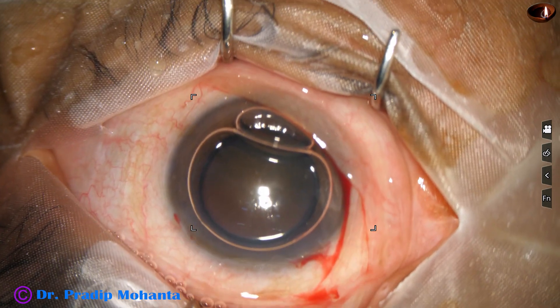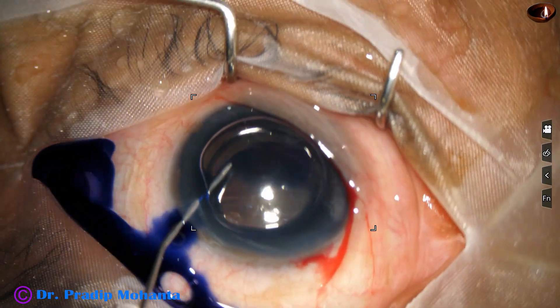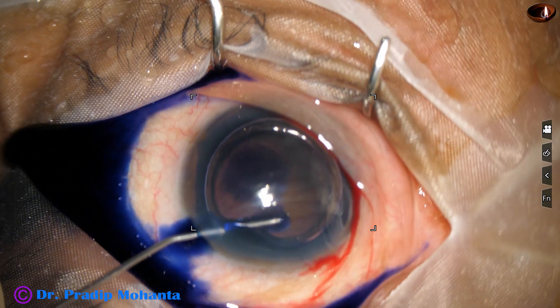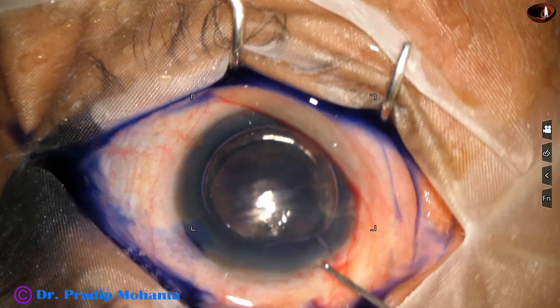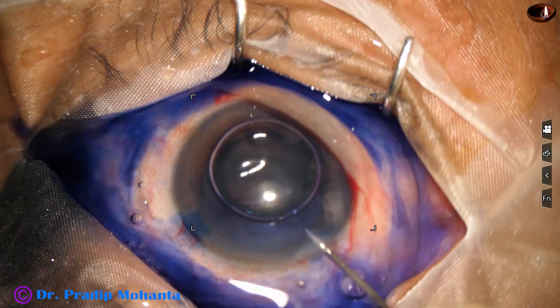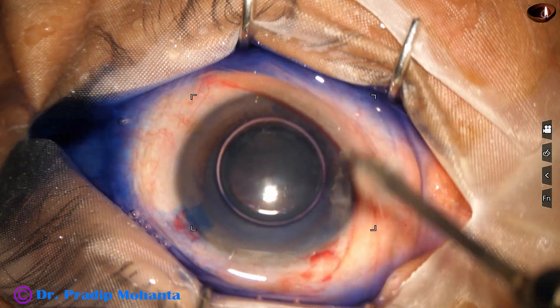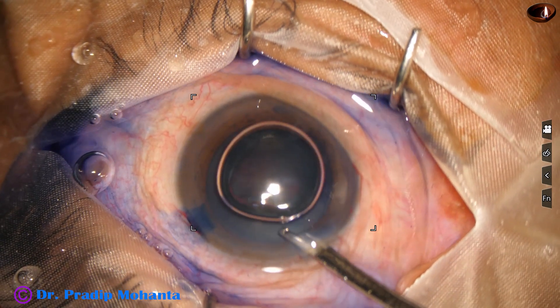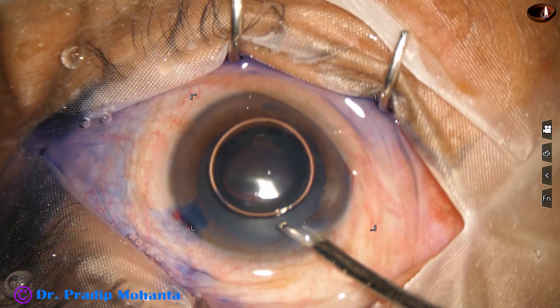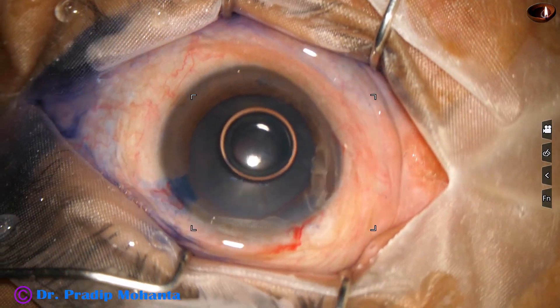I usually do it underneath an air bubble. The dye is undiluted by aqueous, so staining is very quick. This is adrenaline. This is real-time surgery — see within 10 to 15 seconds the staining is complete, probably because of the air bubble.